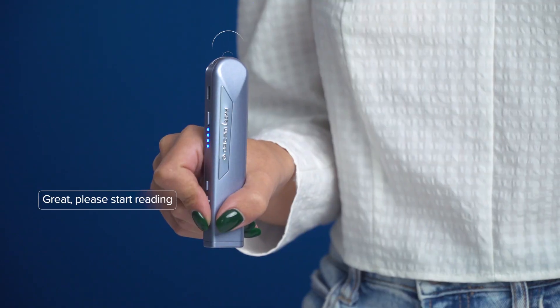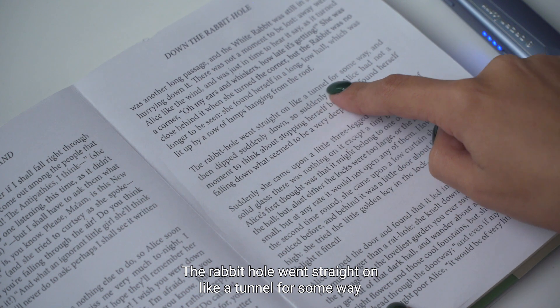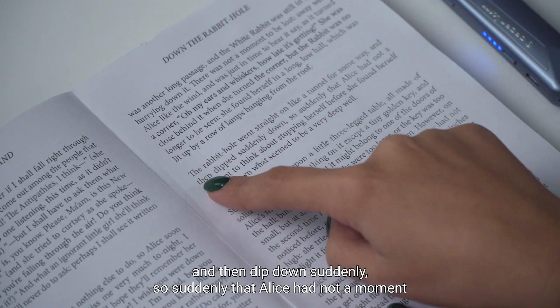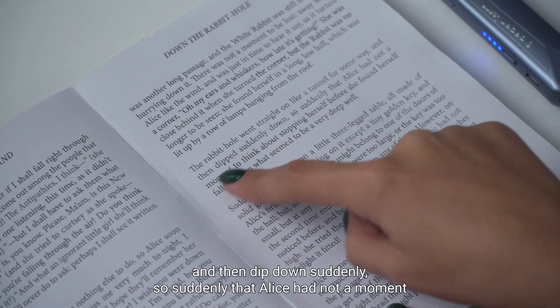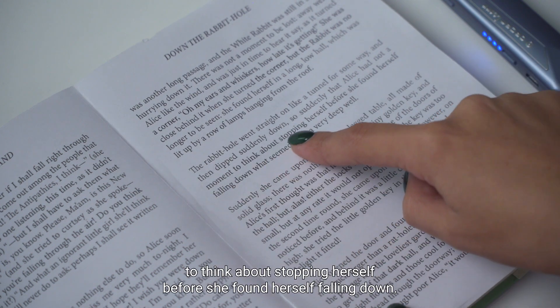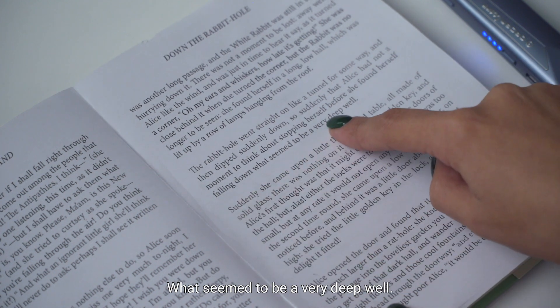Great, please start reading. The rabbit hole went straight on like a tunnel for some way, and then dipped down suddenly — so suddenly that Alice had not a moment to think about stopping herself before she found herself falling down what seemed to be a very deep well.